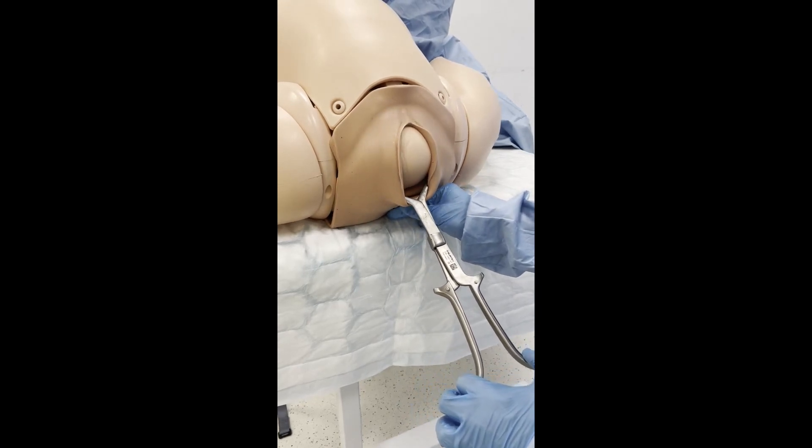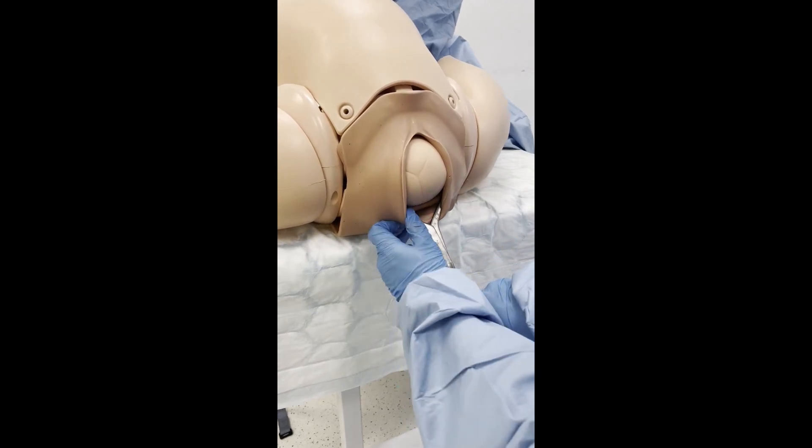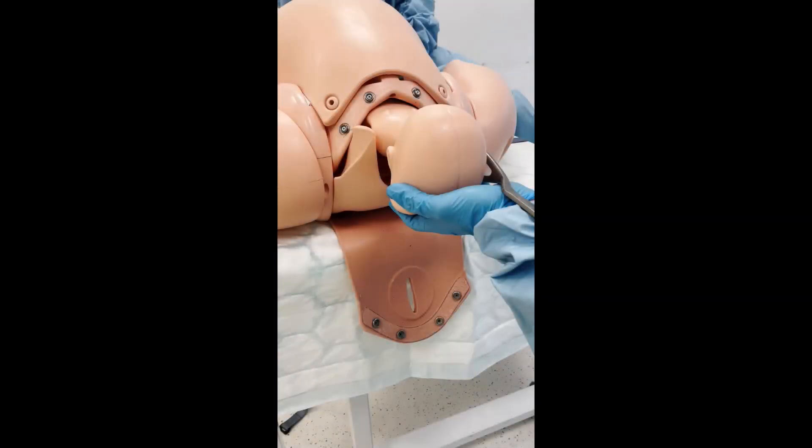Support the perineum and perform an episiotomy when the foetal head is crowning. Upon delivery of the foetal head, remove the Kielland's forceps. Finish by delivering the baby.